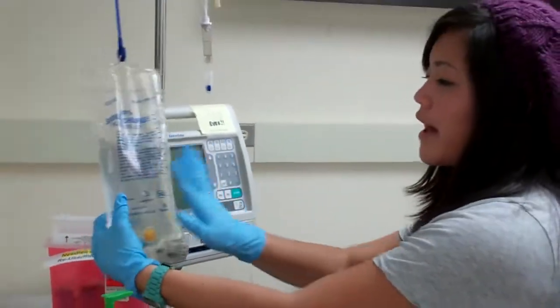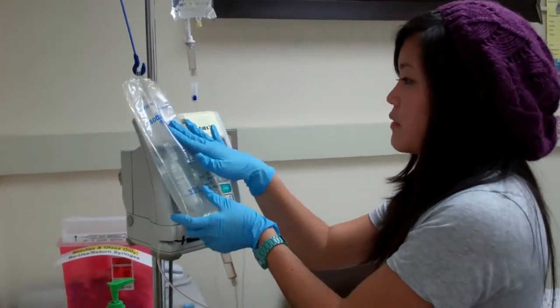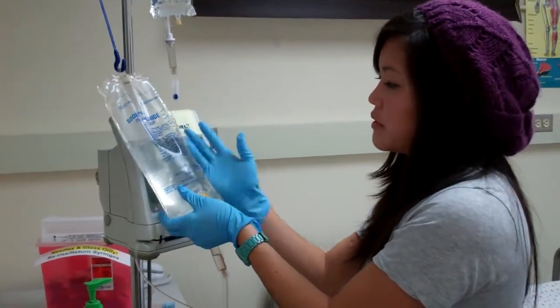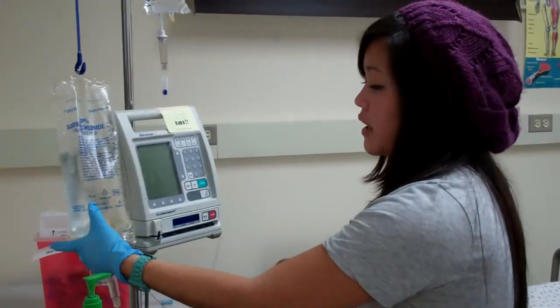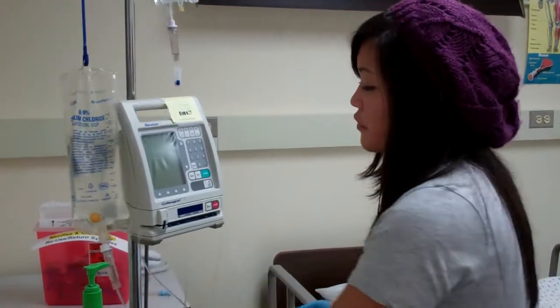So I have everything ready. I also want to make sure that I have my primary bag labeled too, with the name, the dose, the time that I started it, and my initials, and also have this tubing labeled too. It's also good for 24 hours.